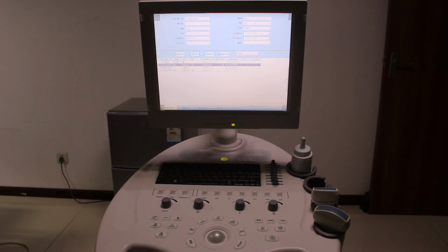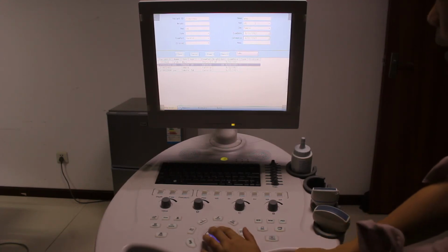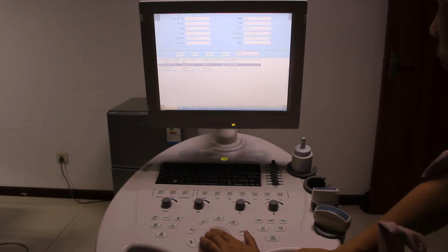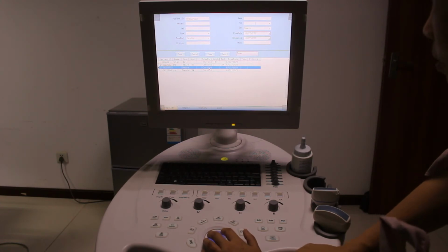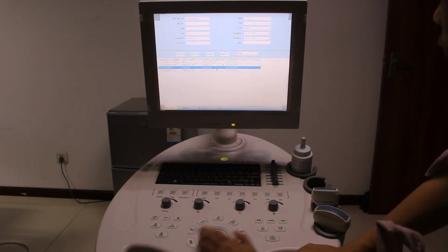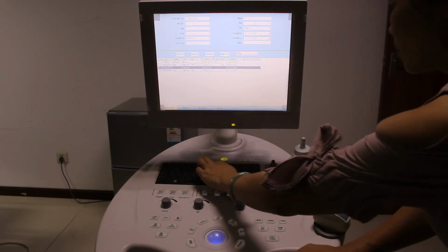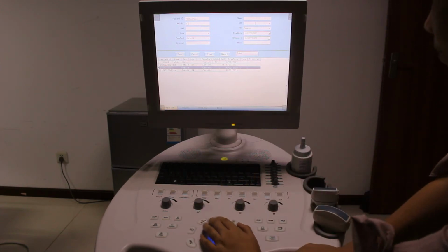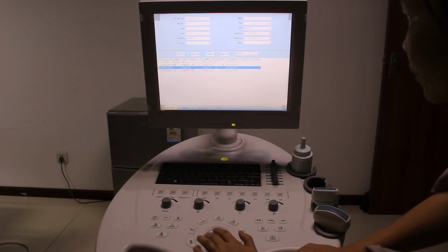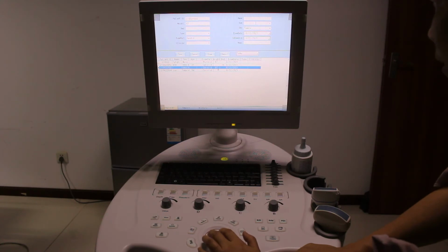When we go to the register page, there are four buttons: save, cancel, exam, and report. First, we can choose one record of a patient. Let's say this one. We want to add or remove some information. Then we choose it, and input, let's say 87, and then we press save. Now you can see in this record, the weight is 87.